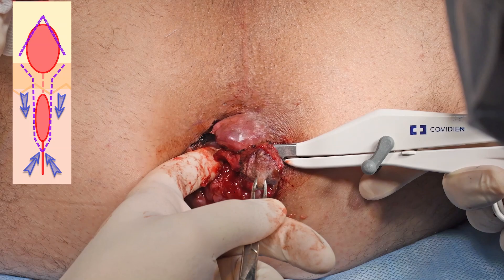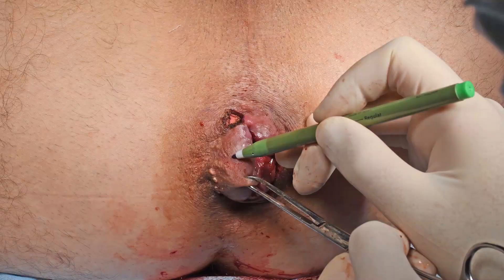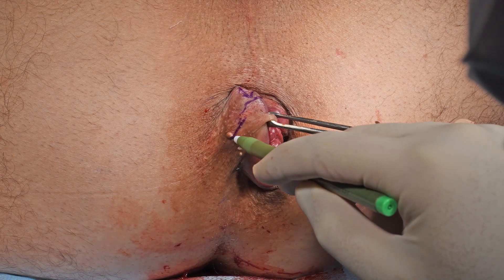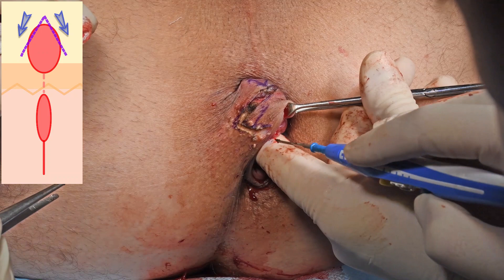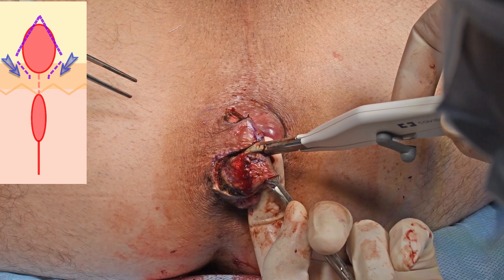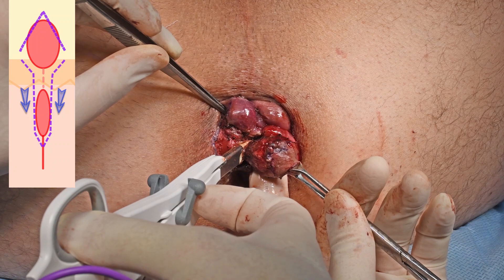The same procedure is performed for the right posterior haemorrhoidal plexus. The combination of two devices results in bloodless and precise excision with absence of suture in the anal canal. The jaws of the device are applied perpendicular to the pedicle to finish excision of this haemorrhoidal complex. The wound is inspected to ensure satisfactory hemostasis.